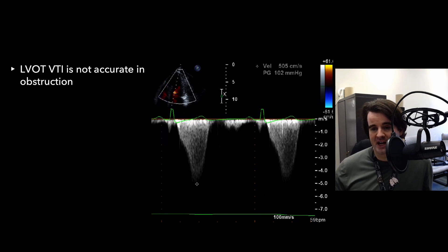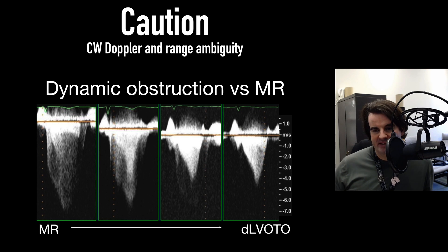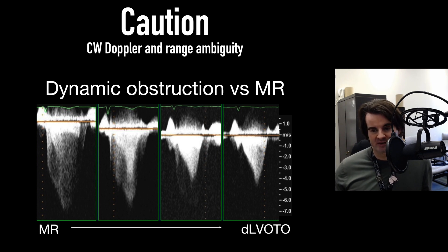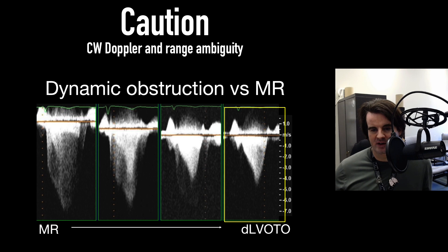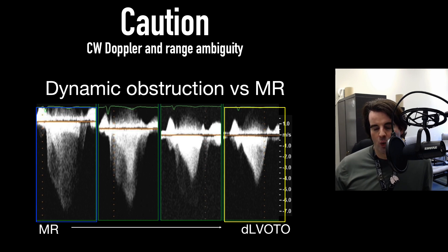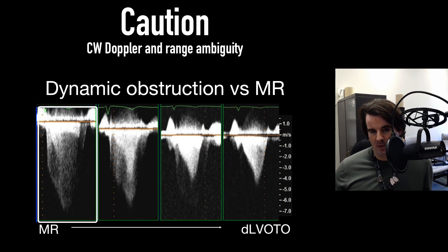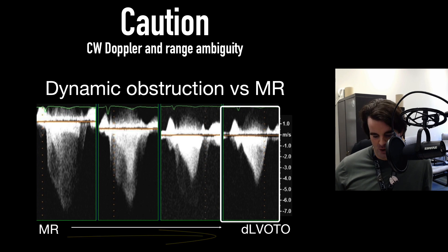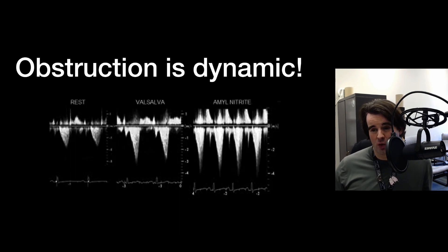Importantly, VTI tracing is not accurate in obstruction, so use caution in trying to trace it to produce a stroke volume. There can be mixing of signals from dynamic obstruction versus mitral regurgitation. With systolic anterior motion, there can be a significant posterior-lateral jet. On the apical five-chamber view with CW placed there, you can mix LVOT and MR signals. It's important to recognize the difference: MR starts right at the onset of systole, whereas the outflow tract signal shows that dagger shape as blood tries to escape.